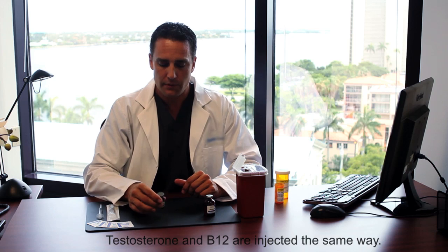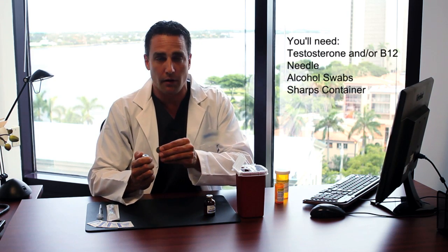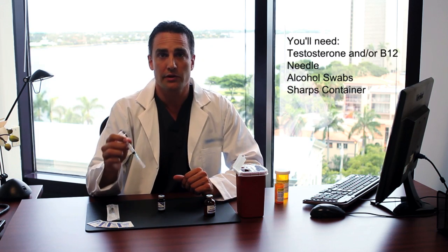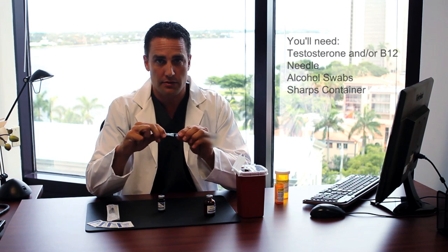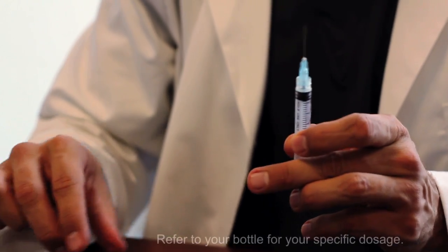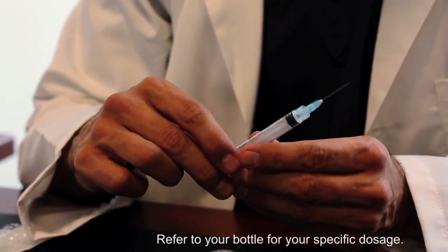At this point, go ahead and put your thumb on the protective cap on the testosterone and pop that off. For this injection, we're going to be using the 23 gauge 1-inch needle. Give that protective sheath a twist to make sure the needle is on very tight. At this point, our goal is to inject 1 milliliter of testosterone cypionate.